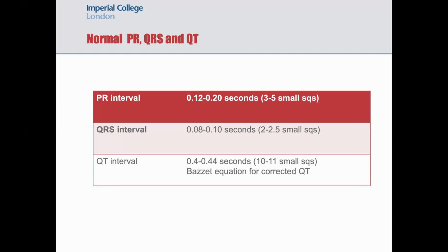If you're really tachycardic, your heart has to repolarize quicker than someone with a normal heart rate. So just because you're tachycardic doesn't mean that you have a problem with your QT interval.